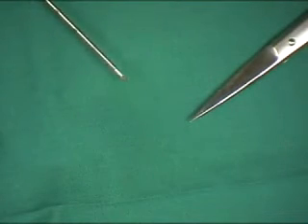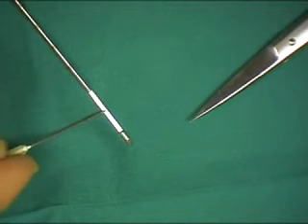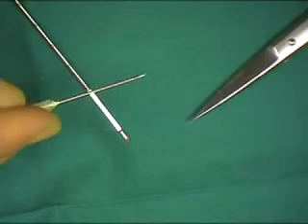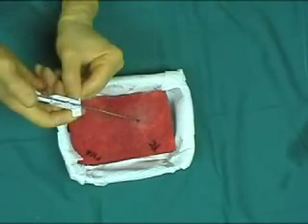The specimen can be examined by advancing the central part and removing the tissue using a needle. In the next demonstration, a small incision is made in the skin with a size 11 blade. The Tru-Cut needle is inserted and the central section advanced whilst holding the outer sheath in position.